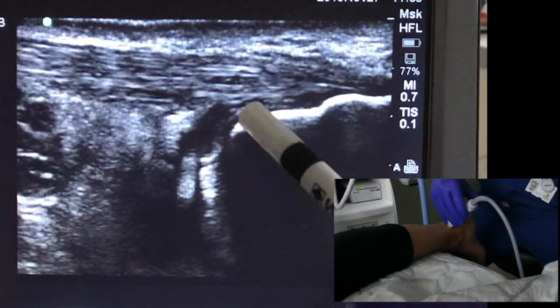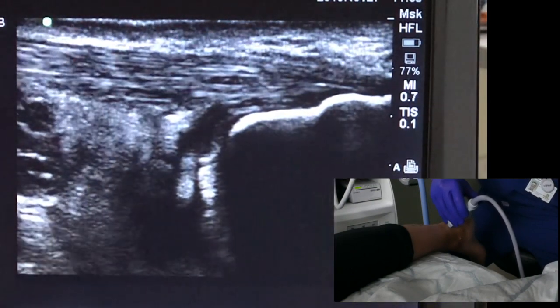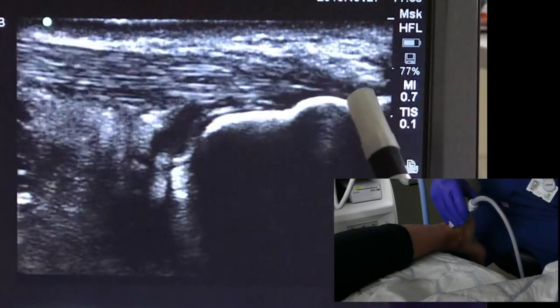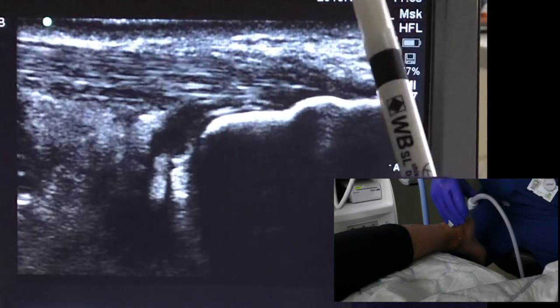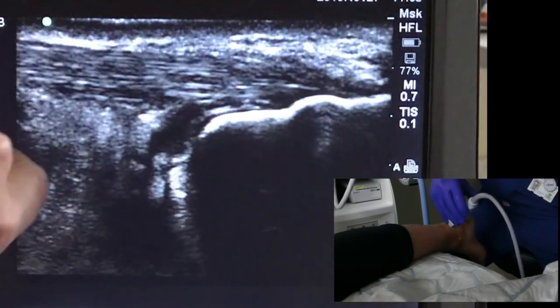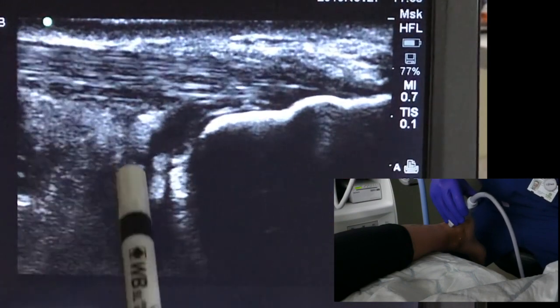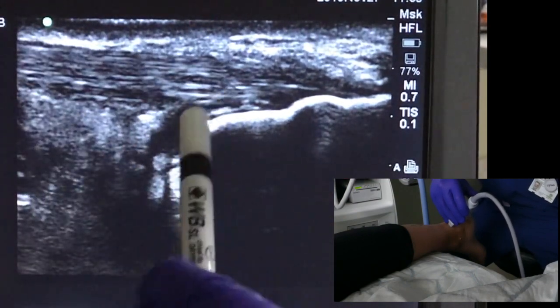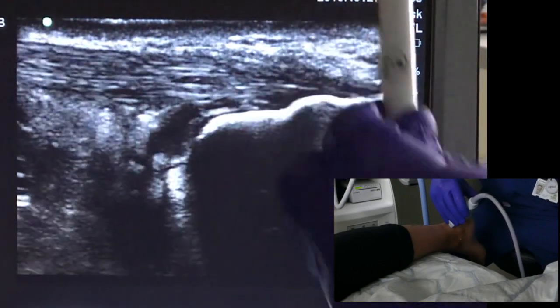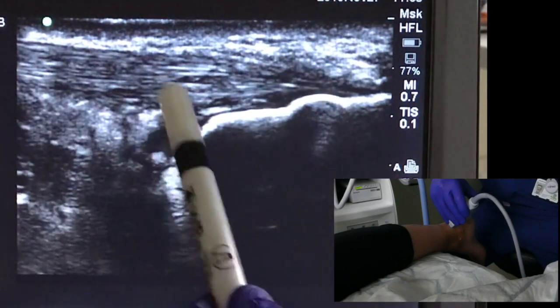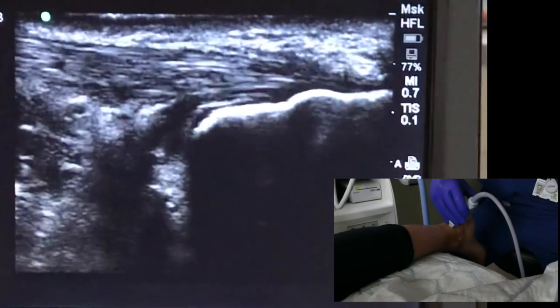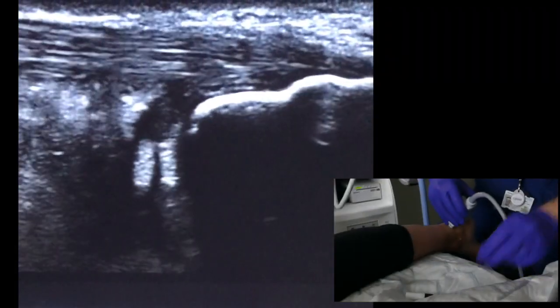So here is where we're looking at — here's the retrocalcaneal bursitis. Just reorientate: here is the posterior calcaneus, this is the back of the heel, this is the Achilles here. Skin here, proximal, distal. This would be Kager's fat pad just here, and this is the bursa coming off here. So the Achilles is here and is known to be thickened as well, but it's mainly this retrocalcaneal bursa here that's thickened.